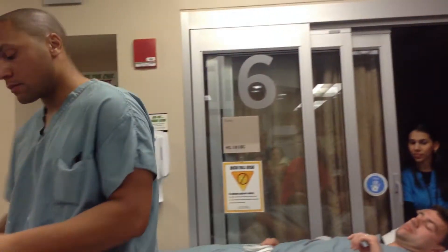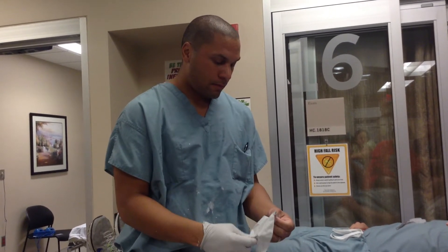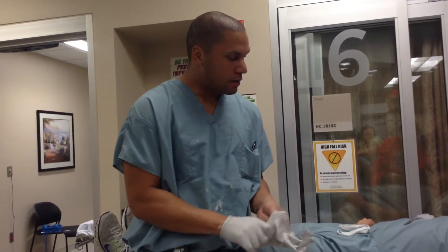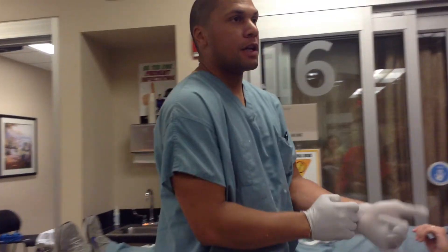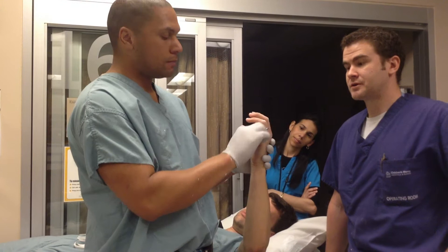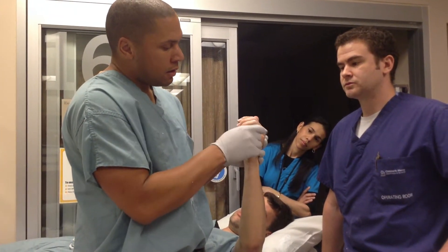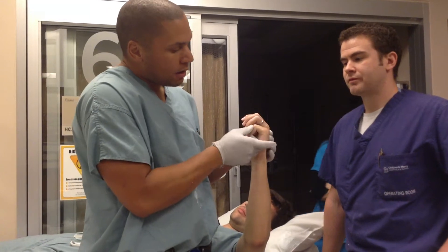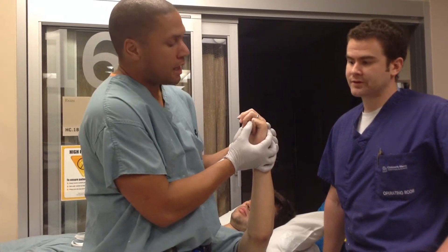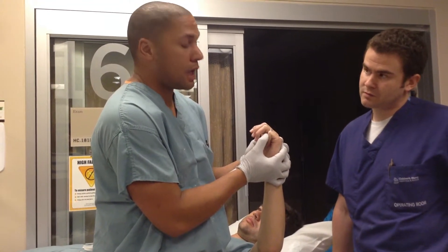This is one of the reductions you can do, and there's a couple different ways to do it. There's something called a 90-90 reduction, where they have that angulation right there. You just bend the MCP to 90 and bend that IP joint to 90, put your finger back there where that fracture is, and you just push — it reduces itself, and it works really nicely.